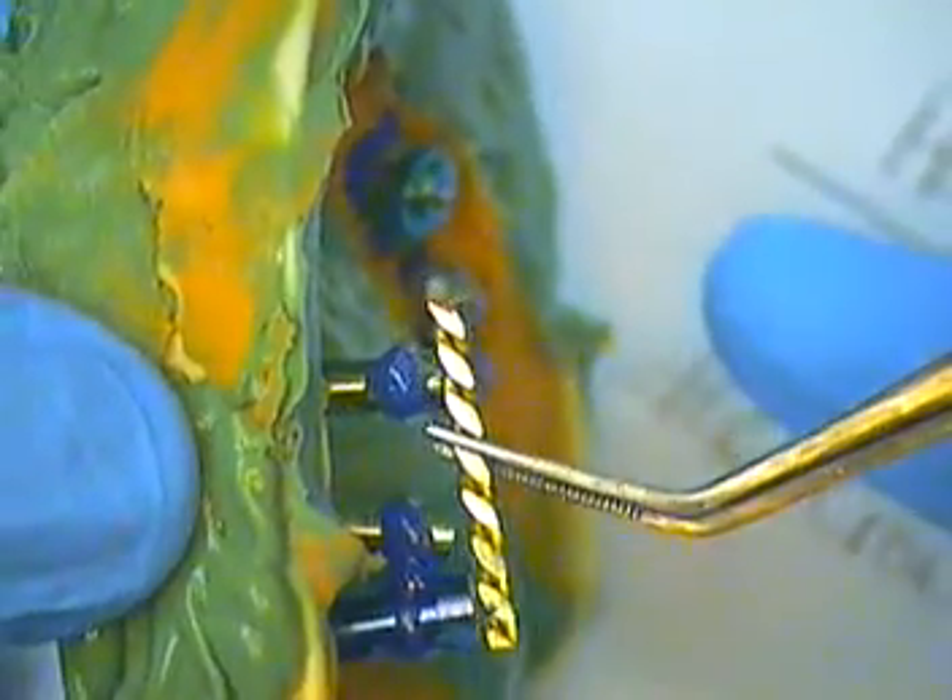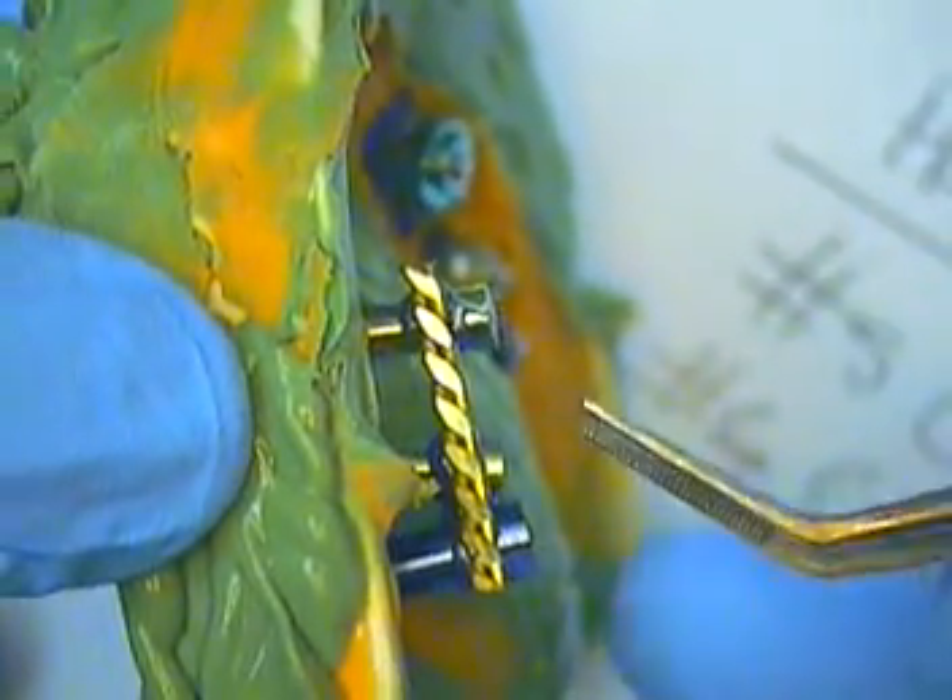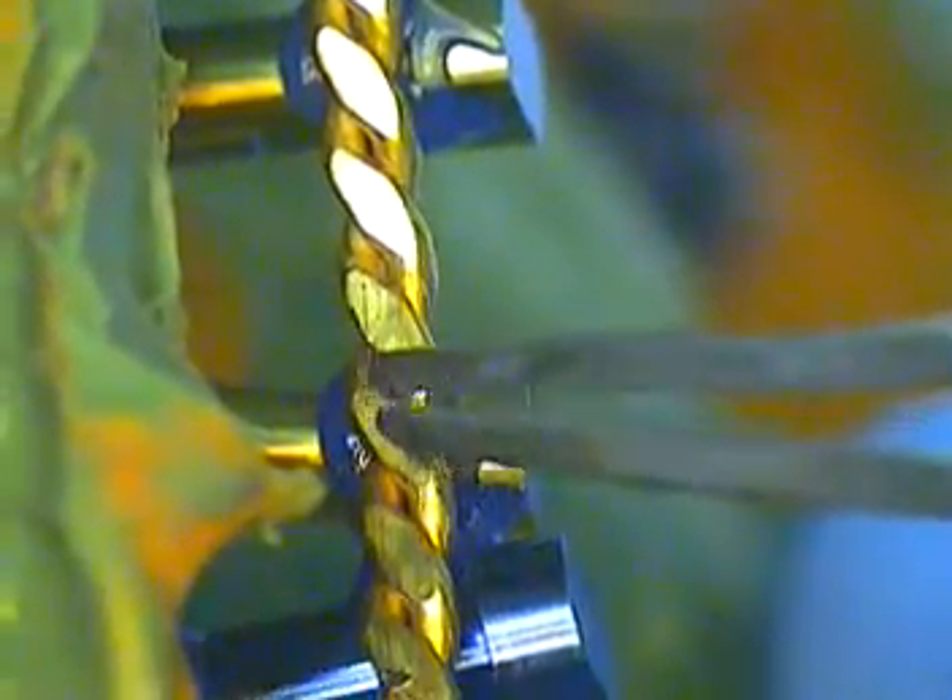There we go. I've already pre-measured this bar. Let's get this in place and then we'll light cure, and then we'll wrap this a little bit more with composite. Here we go. We just set it like that. Let me zoom in. Now it's kind of resting in a nice position — I like to keep it more upright. You might want to just shut your eyes real quick because I'm going to light cure with the filter, and we'll just spot cure this in.